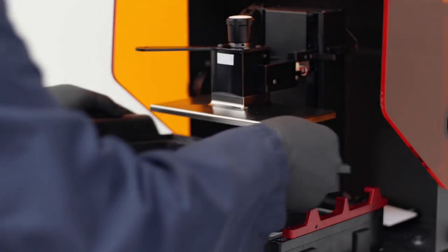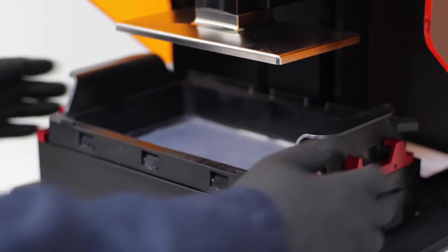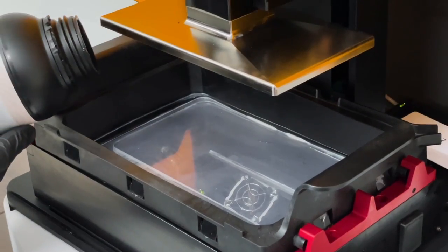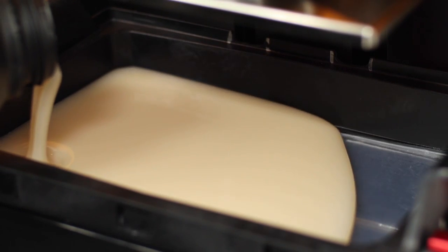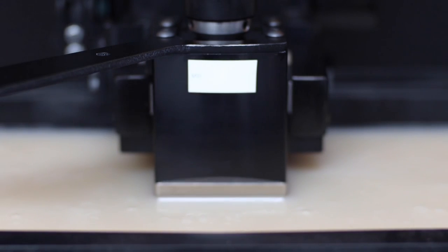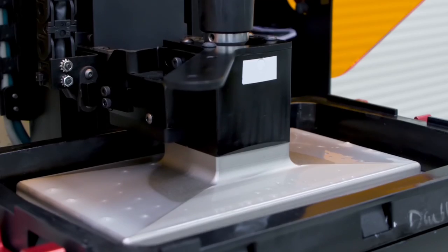First, for printing we set up typically for an immediate denture with supports on the intaglio surface, the fitting surface of the denture. Typically it depends, we either print horizontal or at a 45 degree angle with the denture if it's going to be an immediate denture.